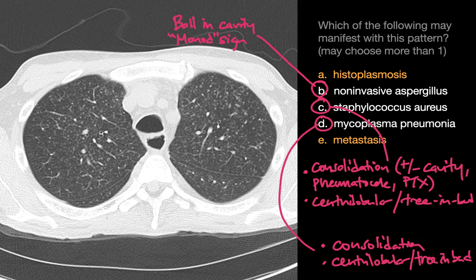Non-invasive aspergillosis should not manifest like this — it should usually manifest as a monod sign, a ball in the cavity. Staph and mycoplasma infections can manifest as either centrilobular or tree-and-bud nodular interstitial patterns, or consolidation. Consolidation in cases of staph can potentially cavitate, and you might see additional complications in the setting of a cavitating consolidation.